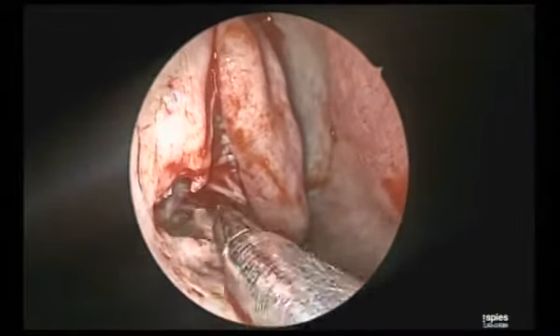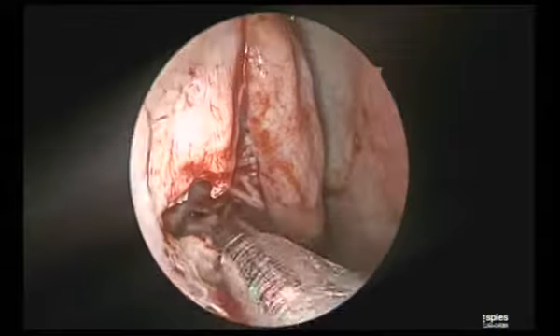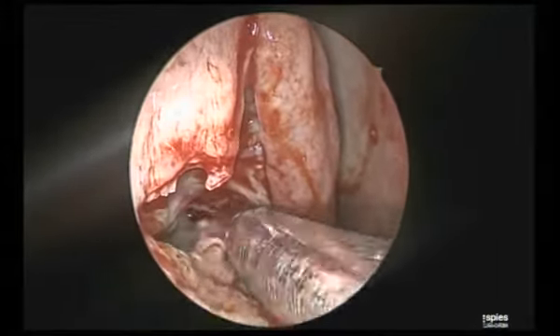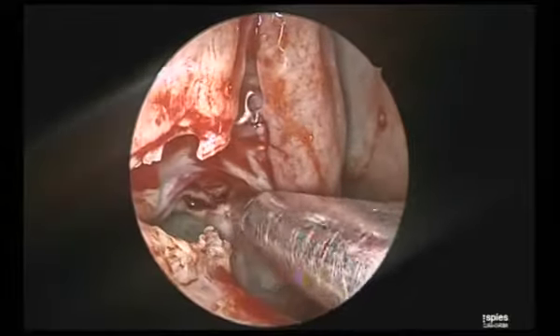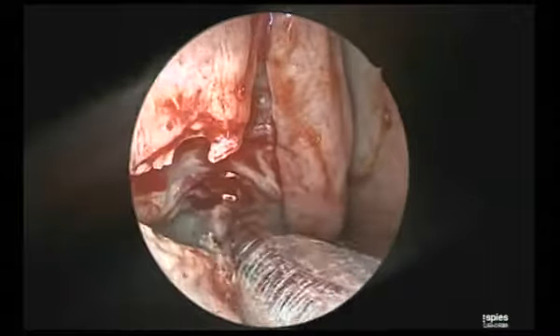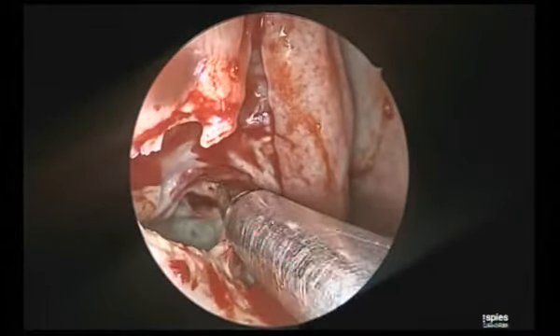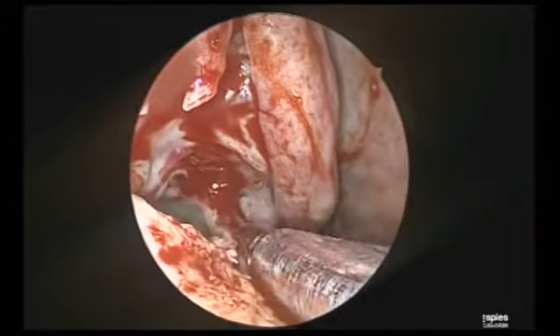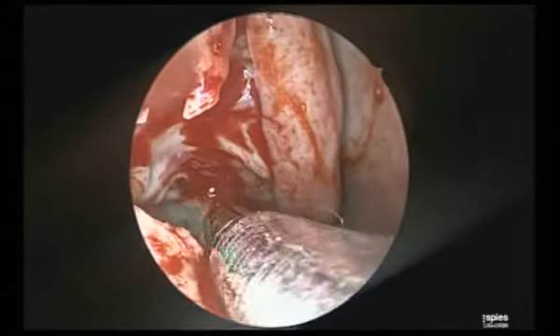So I'm doing the same steps. We can utilize this time for the discussion. Anything important I find, I'll keep commenting. See now, important here is, you said your job is over. What is there in the maxillary sinus? See the purulent discharge. So we operated on the wrong side, I think.